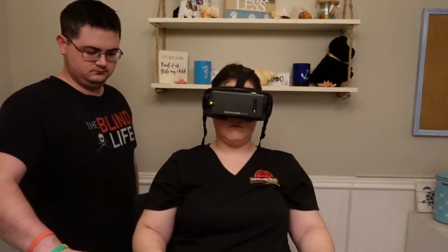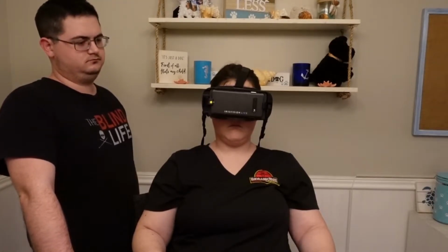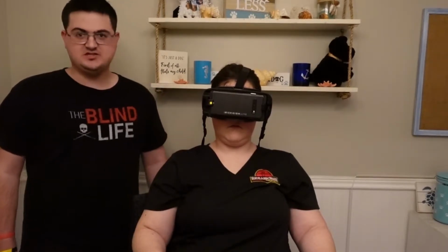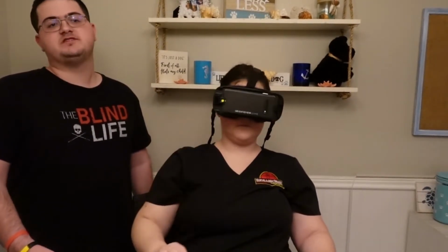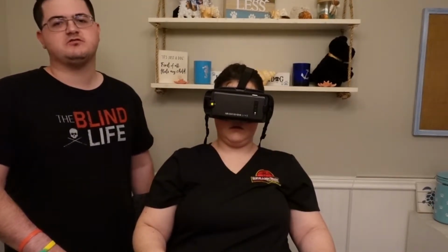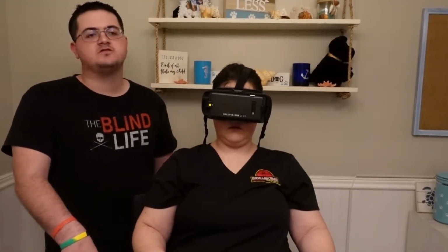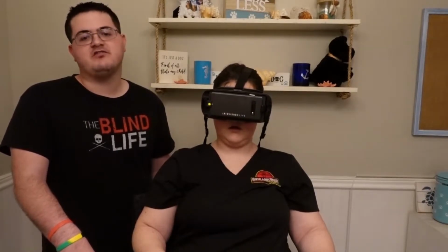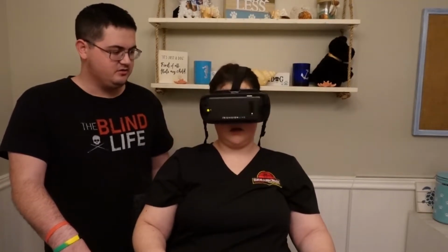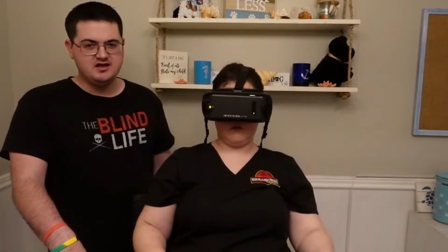There are 6 available settings: theater, which is the default setting, very dark, dark, dim, ambient, and bright. But basically this is to help you look at a screen. Because the problem with television, especially with someone with RP or a genetic disease like macular degeneration, is that it's going to be harder for you to see the screen, or the glare is going to bother you a lot. But with RP, you don't see the whole screen. Yes, exactly.